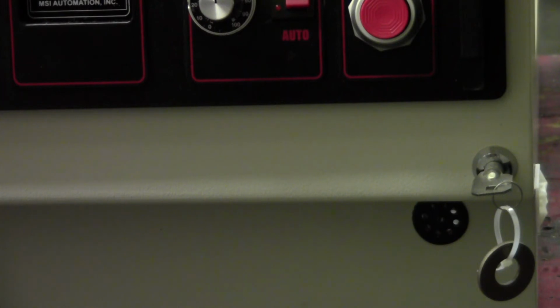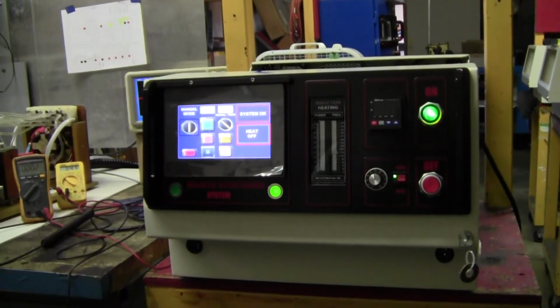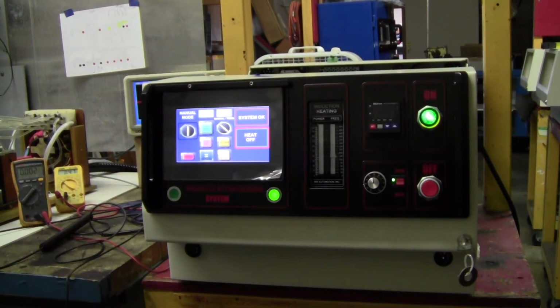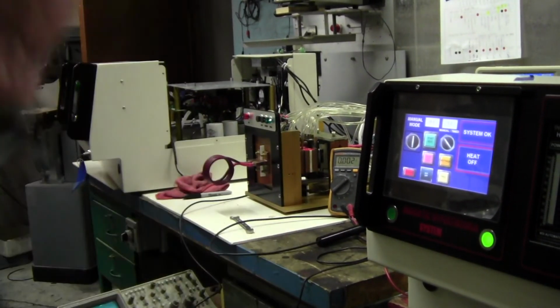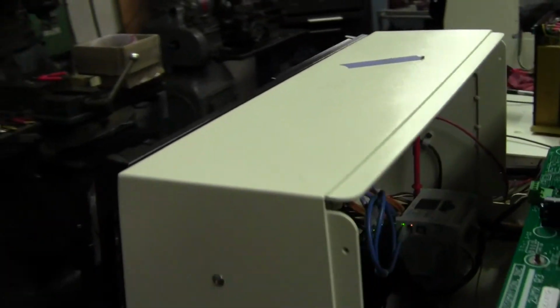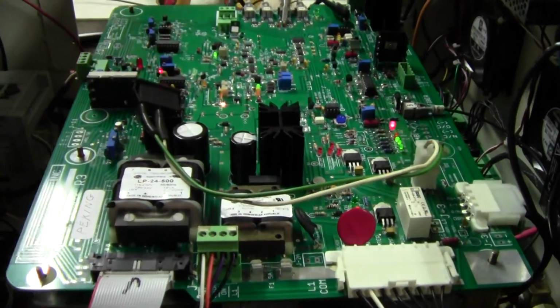The green light is okay. You have 4 transistors that produce the heat, okay? They're mounted on the bottom of the middle board. Each transistor has its own separate power supply. Each power supply has a green LED. So that's the purpose of the green LED. It shows that the power supply is running. And then you've got the top board, and I have literature that I provided in the instruction manual, and it shows what all the LEDs are on the top board.